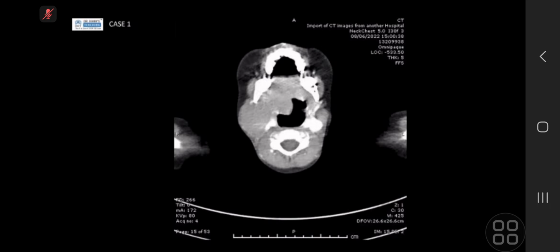But all the other differentials, as you said, are within reason. The only thing here is that I don't think it's as vascular as I'd expect the others to be, and this is quite homogeneous. The other thing I'll be thinking of in the head and neck is a parotid gland tumor, polymorphic adenoma also. Parotid space tumor from the parotid gland on the right side is solid, so I can add the polymorphic adenoma from the parotid gland. Yeah, that's true. But often those are a little bit more in the adult population than the children's population.